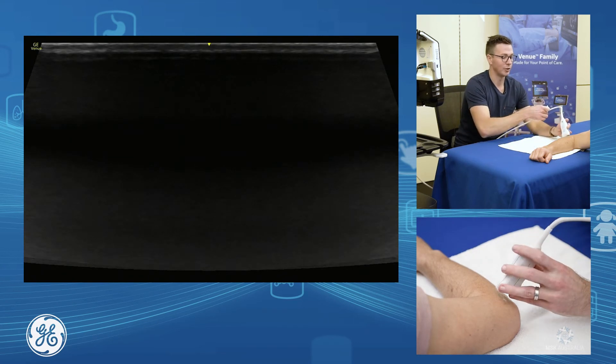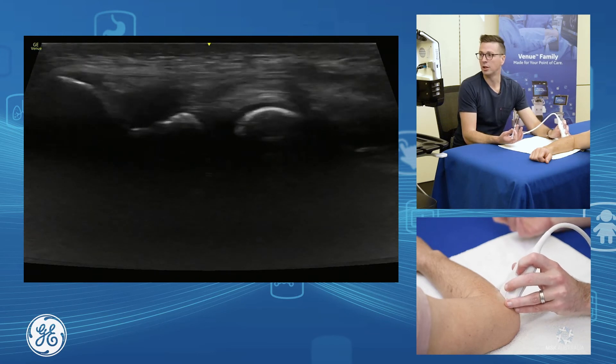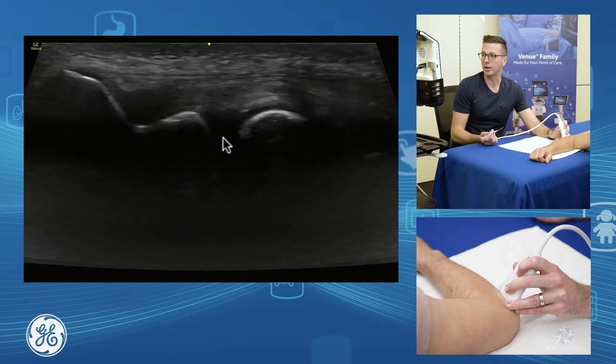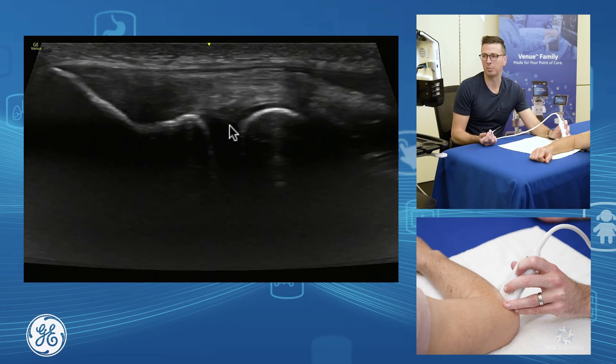This approach also gives us a really nice way to inject our elbow joint, because what we have down through here is our humerus and our radial head. In between, underneath that radial collateral ligament, is our elbow joint — and it's a really nice way to be able to inject the joint.